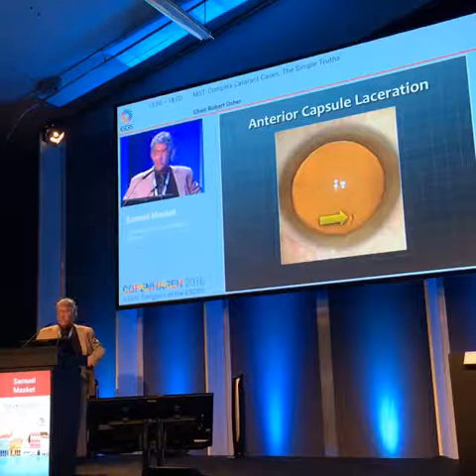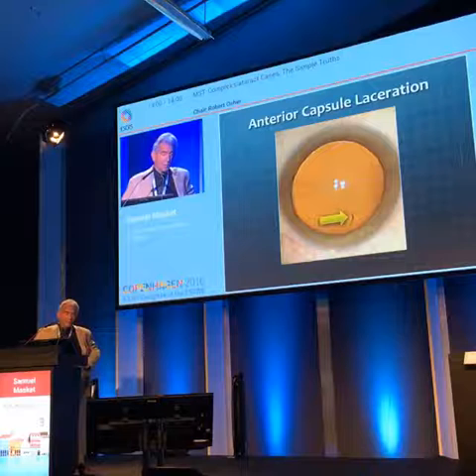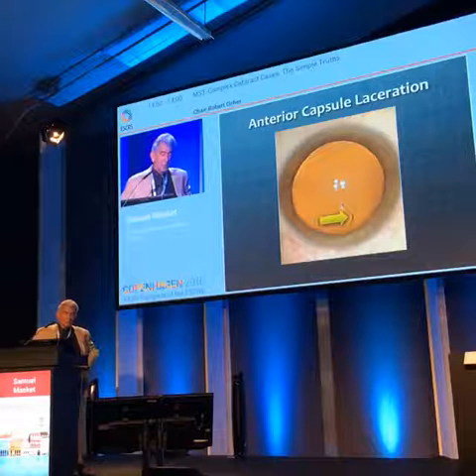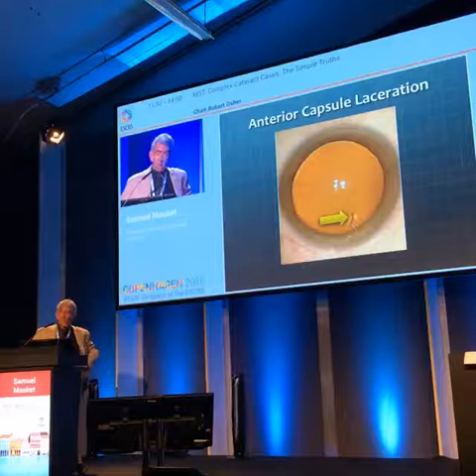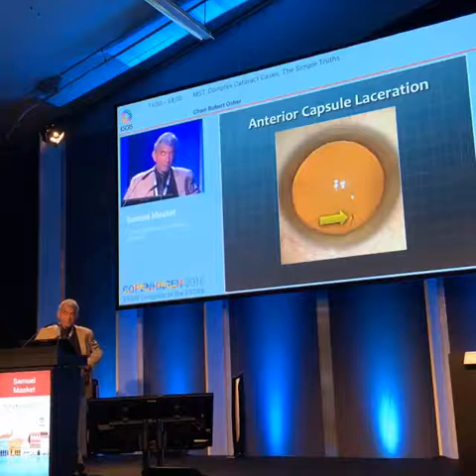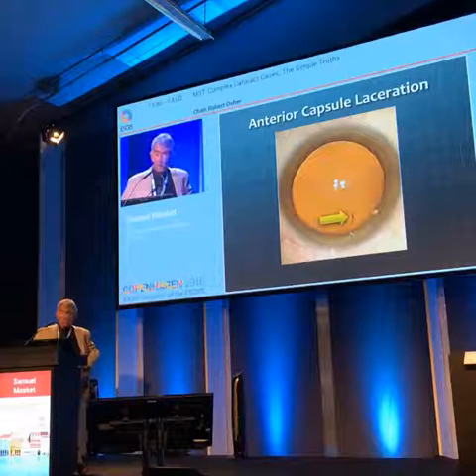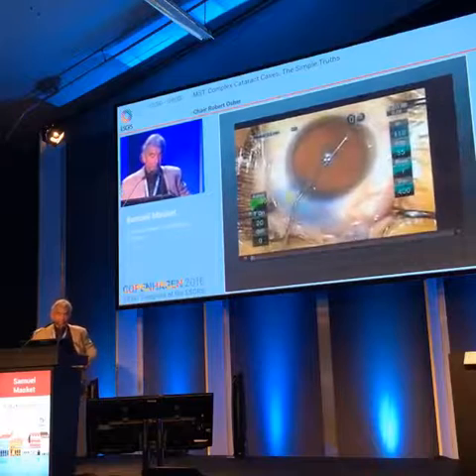And you can debate whether it's better to watch this or whether it's better to approach it. My concern was that any changes in the lens material might severely challenge our ability to do anything we'd like to do with this capsulotomy. We cannot use a femtosecond laser to try and get around this. So we have only really a series of tools that can help us.